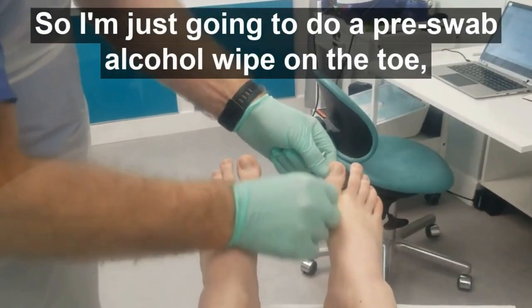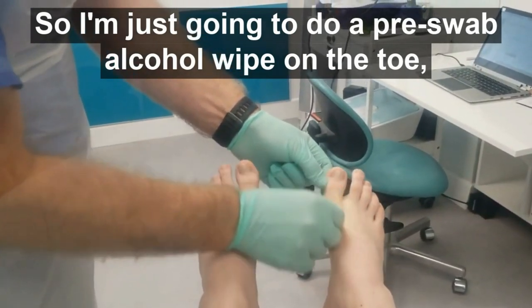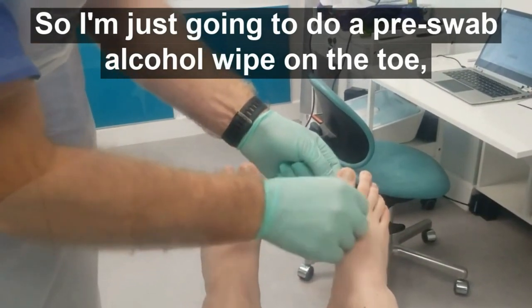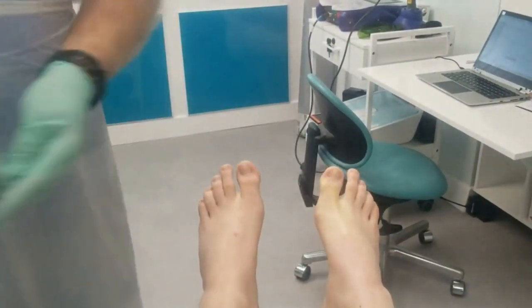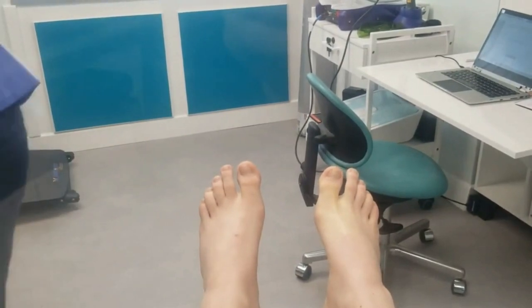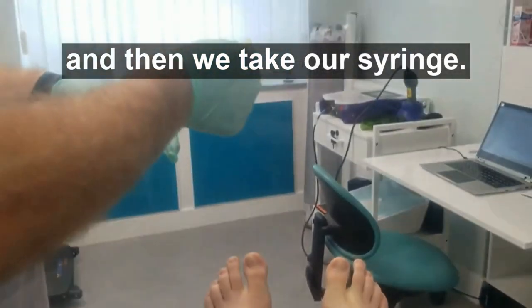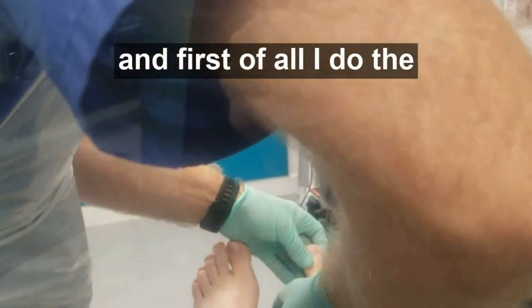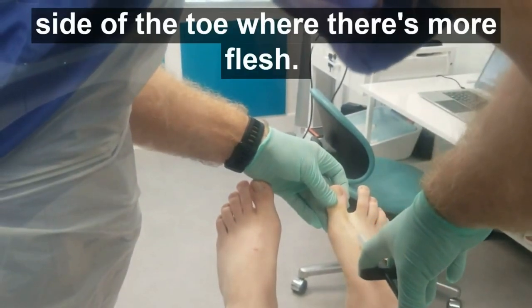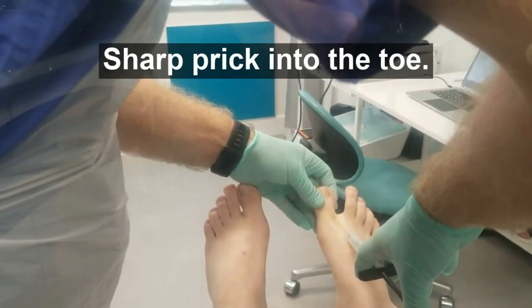I'm just going to do a pre-swab alcohol wipe on the toe. Then we take our syringe, make sure there's no air in it. First of all, I do the side of the toe where there's more flesh — sharp prick into the toe.